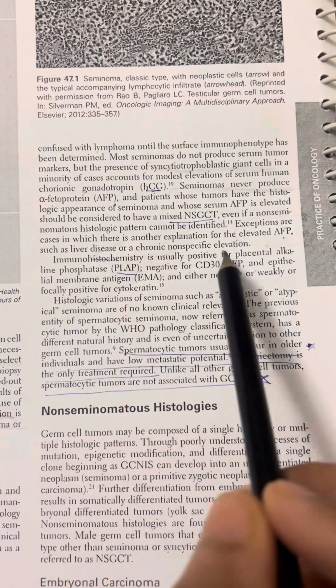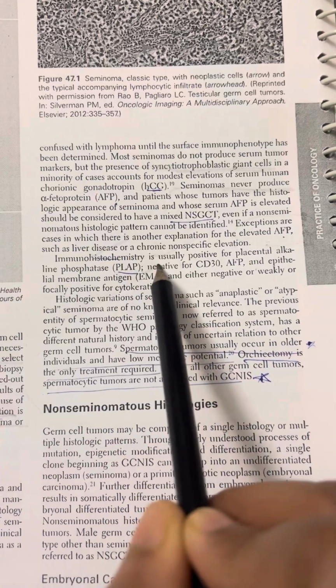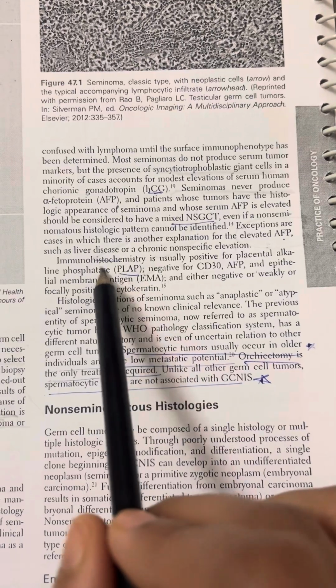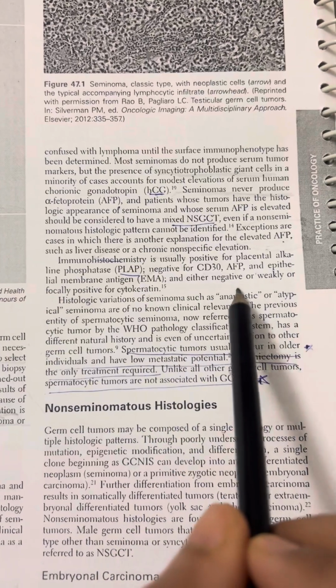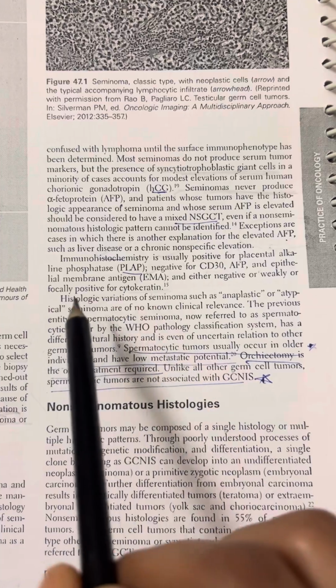So IHC is usually positive for PLAP, that is placental alkaline phosphatase, and negative for CD30, AFP and epithelial membrane antigen, EMA. It is either negative or weakly or focally positive for cytokeratin.